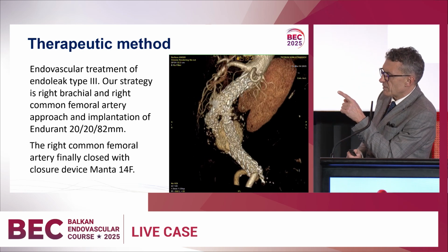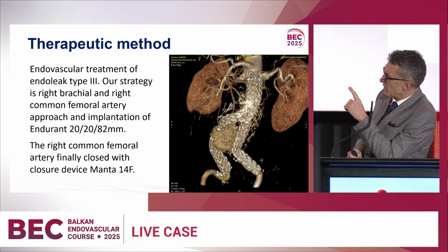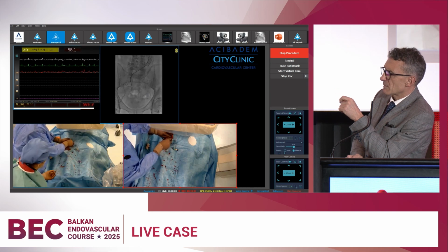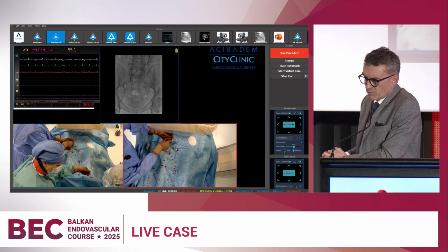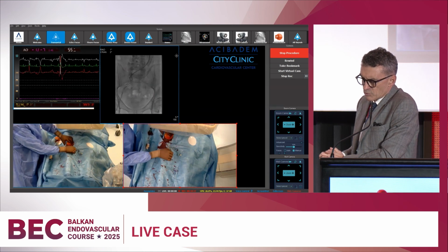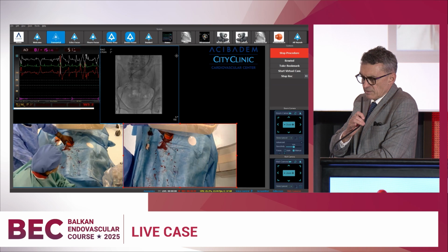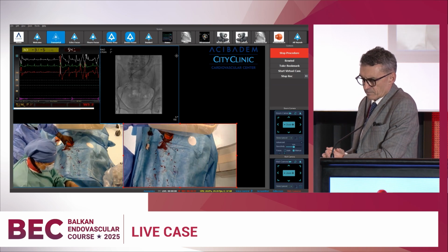And probably you can, Mitko, put on the screen. Are they ready in the cath lab? Are you ready? Ah, okay, excellent. We see you, and we see also the picture of the angio. Zoran, can you comment on what you have done? We can start with the approach.